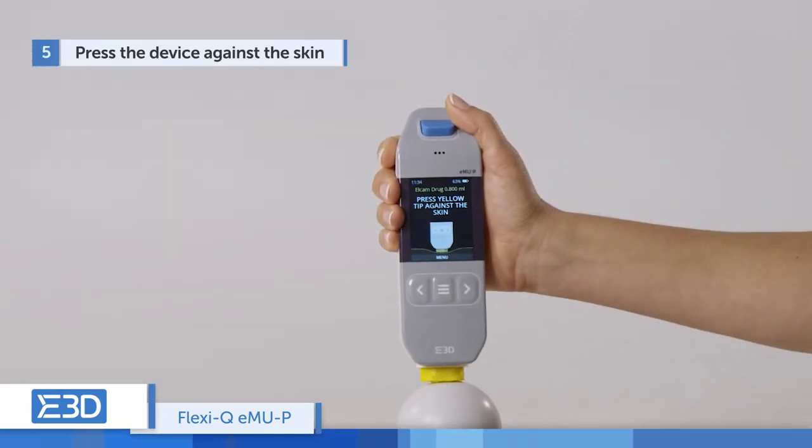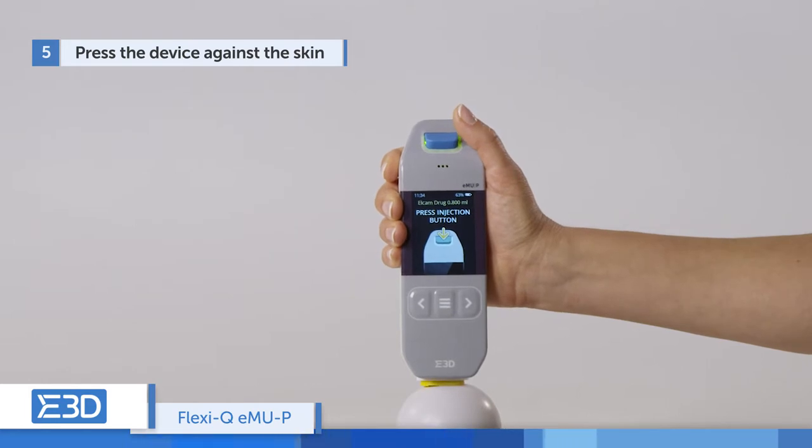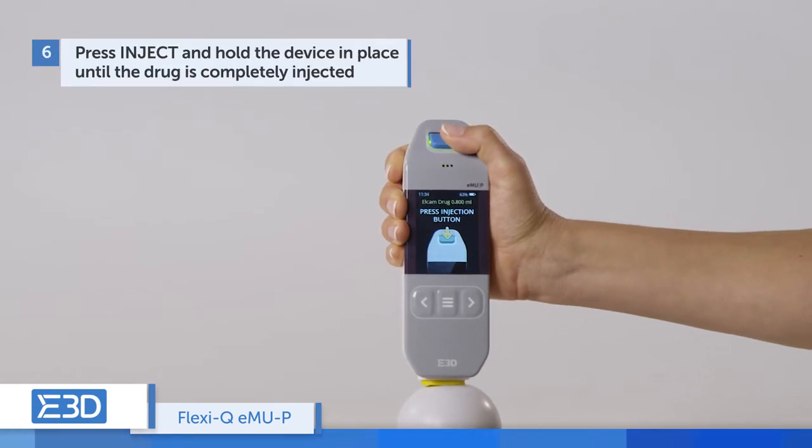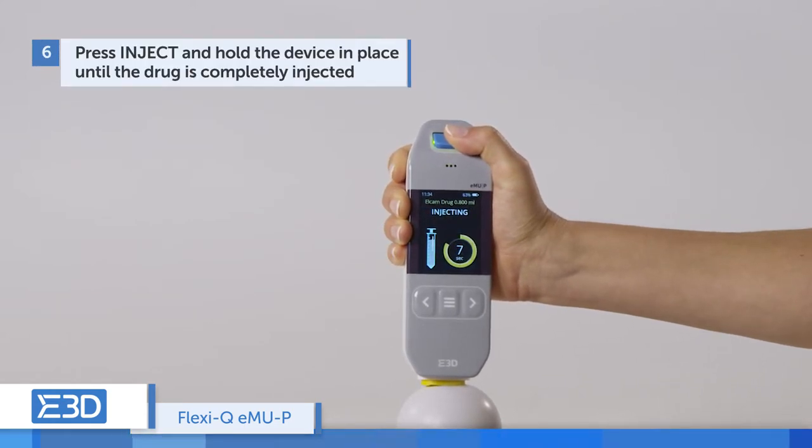Press the device against the skin at the injection site. A light appears around the inject button. Press the inject button — the device is activated, the needle is automatically inserted, and the drug is injected.